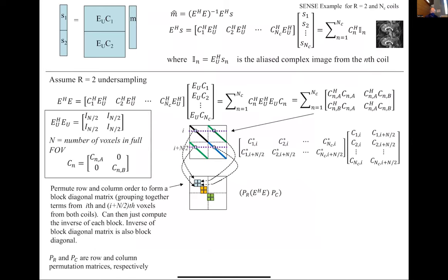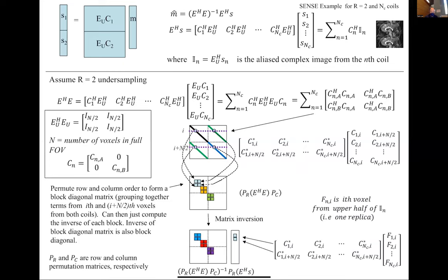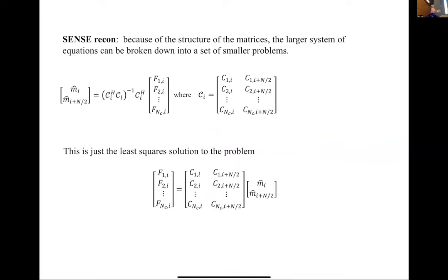I'm not gonna really go through this, it's just showing that if you actually go through all the math and work through it, there's a lot of pretty gnarly math. You come up with exactly the same thing we just talked about, which was this, that you get these different sums and you can estimate your magnetization just by knowing these coefficients.